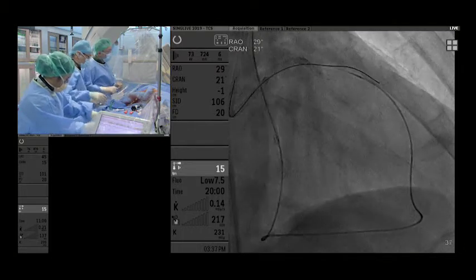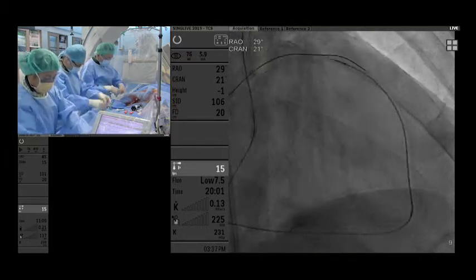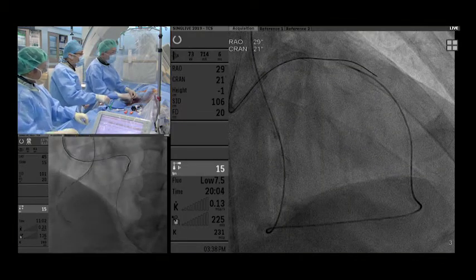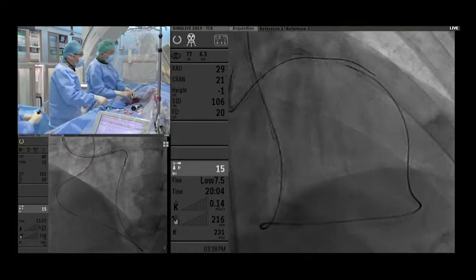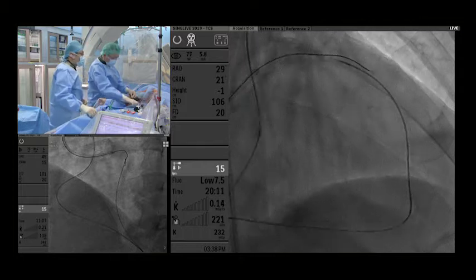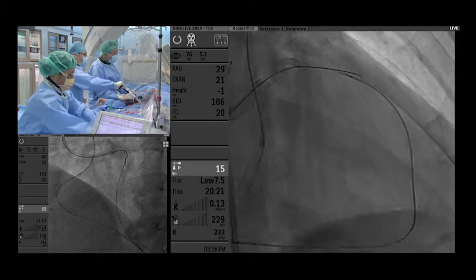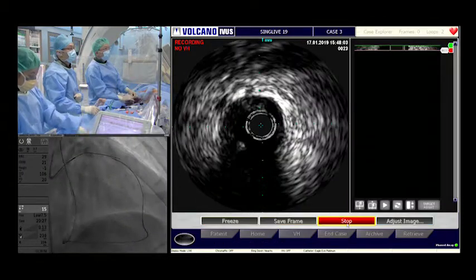Okay, I check IVUS again. So Dr. Ochiai, this is Vasan speaking. So now your guideliner is in the antegrade guide, and your retrograde wire? Yes. Retrograde wire is in, I think, the aorta. Already in the ascending aorta. Pass through. In ascending aorta. Yeah. And now your retrograde wire somewhere is in the subintimal. Before, yeah, I check IVUS. Okay, deflate. Yes. So you must check the IVUS. Yes. Could you show IVUS only to the audience? Okay. Any comments on this state?